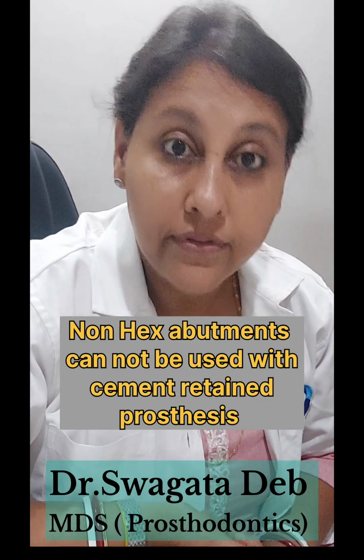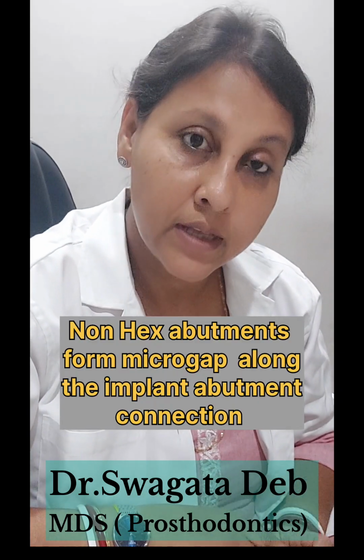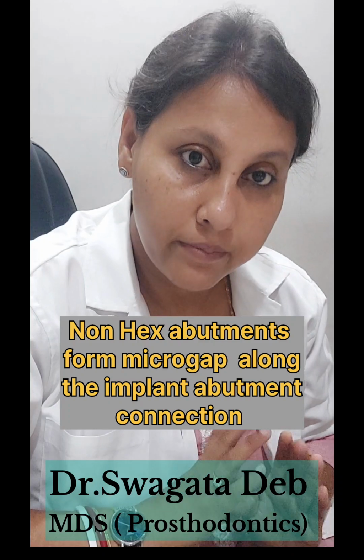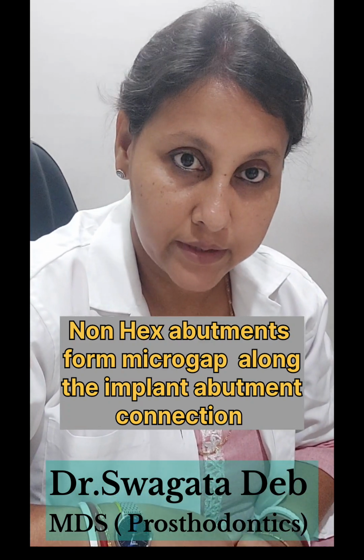Another disadvantage of non-hex abutments is that, since there are no retentive surfaces like in hex abutments, there is a certain microgap present between the implant and the abutment surface.